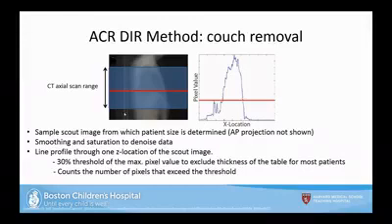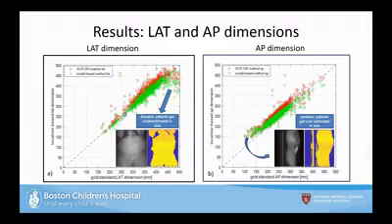If you look at the points on the graph there, they're not too different from the line of unity. So it's not correction anyway. Yeah, right. That's a good point, though. You want your results to be as accurate as possible. So it may be something that we should look at if it becomes a problem, because we only looked at 48 pediatric abdomen and 12 chest. So maybe if we're looking at more data and we find that it actually is a problem, then we would need to do a correction for sure. Yeah, that's a good point.